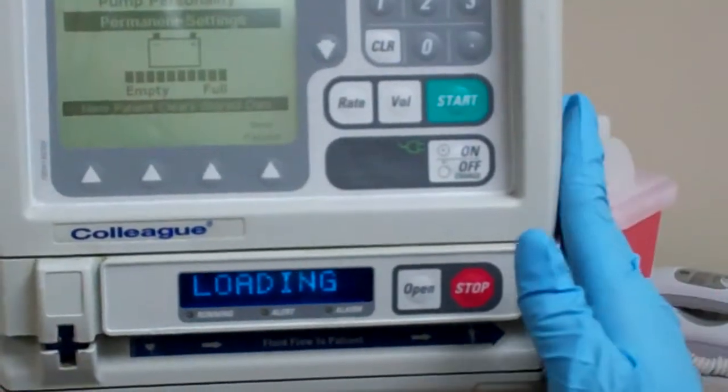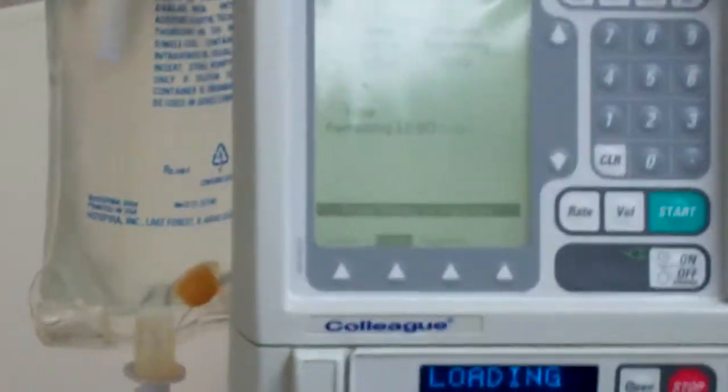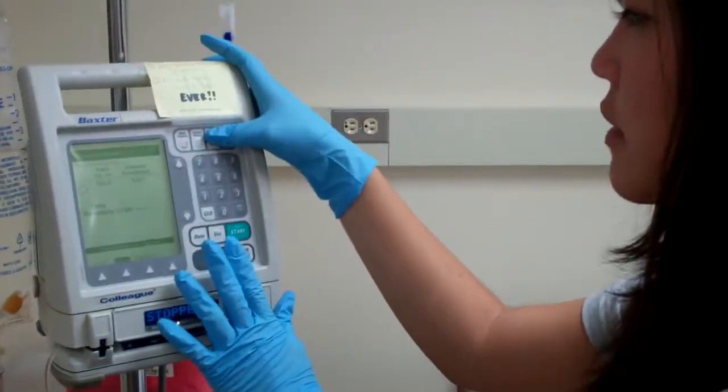Okay, there we go. And then I would set my rate depending on what the doctor ordered, how much he wants it to go over.